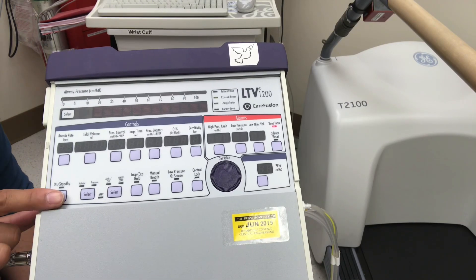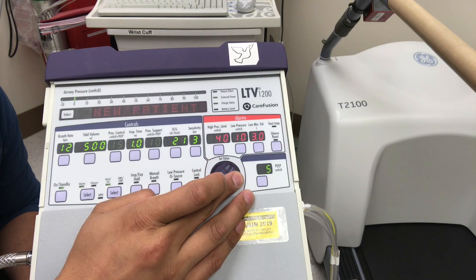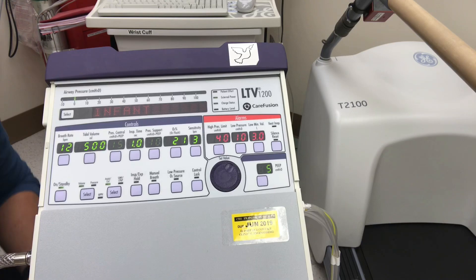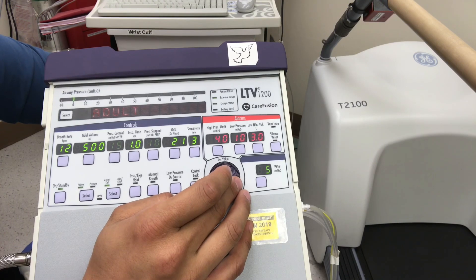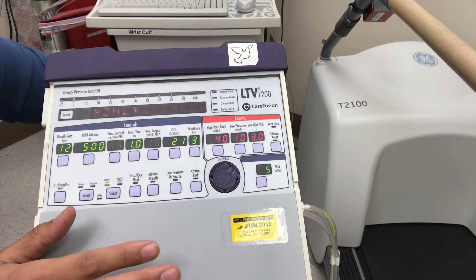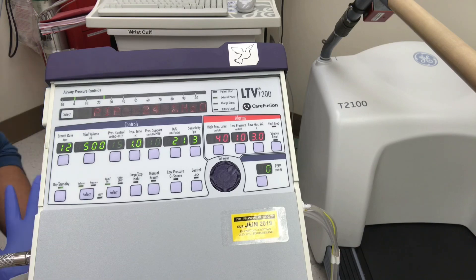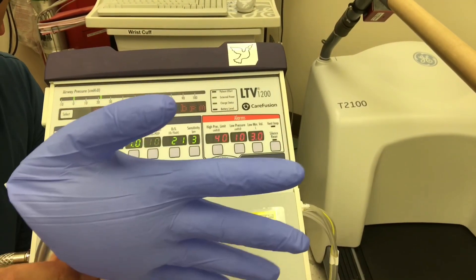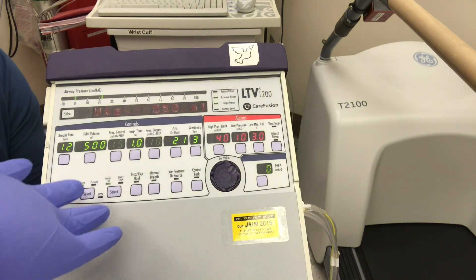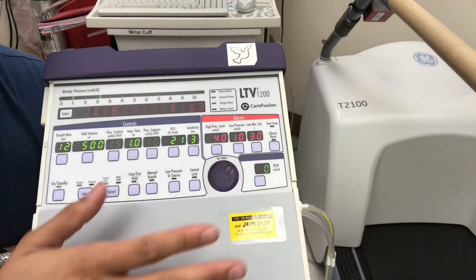Let's turn the vent on. Hit the on button and pull it down. Up here we have a menu with a select button. Toggle the wheel to 'New Patient' and hit select. This gives you choices: infant, pediatric, or adult. Selecting one gives you pre-set typical settings. We'll select adult, which gives us a set tidal volume, set rate of 12, and 500 mls. Now we have our test lung, and you'll notice it's collapsing because we don't have PEEP dialed in.